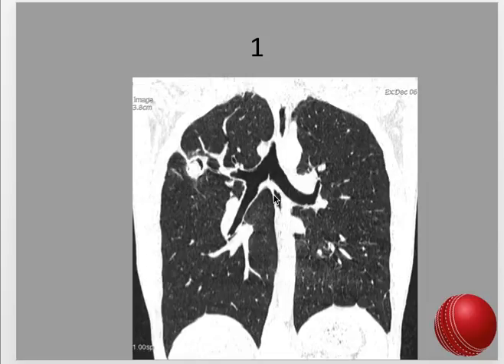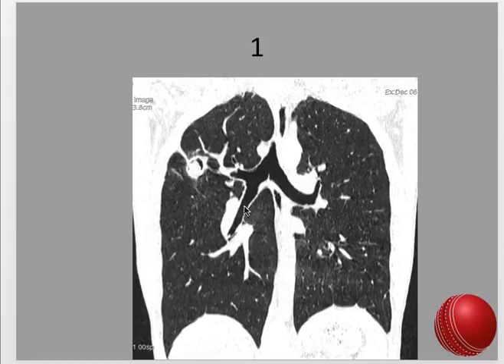Except for the lung, you will not be able to see any other structure — no soft tissue. It is completely bright, whereas you can see the lung and its vascular markings and the pathology very clearly. So this is the normal lung — you can see there is no lesion here. And this abnormality is nothing but a small cavity with some soft tissue content within the cavity, which is producing an air-crescent sign, classic of a fungal ball, also called aspergilloma.